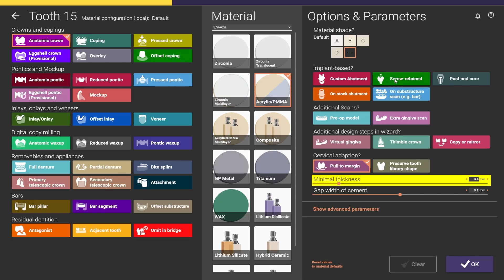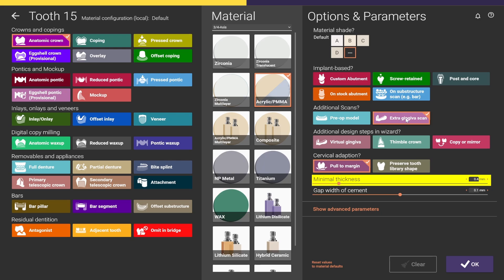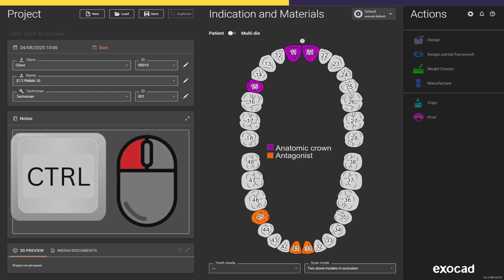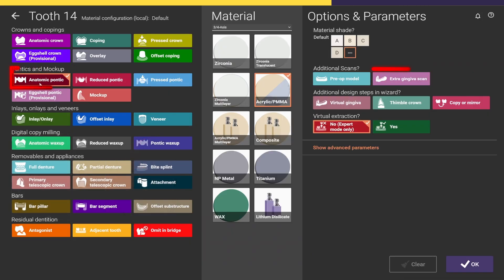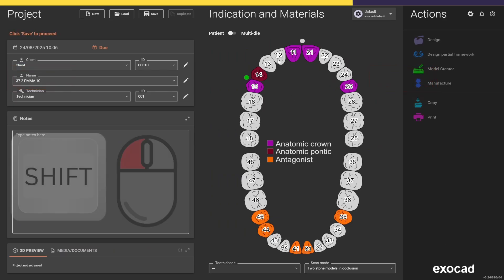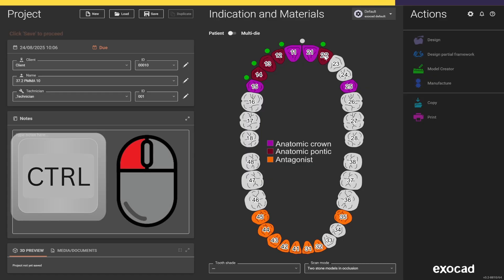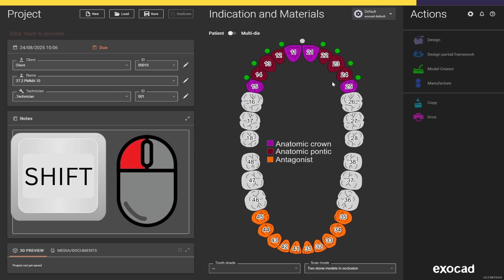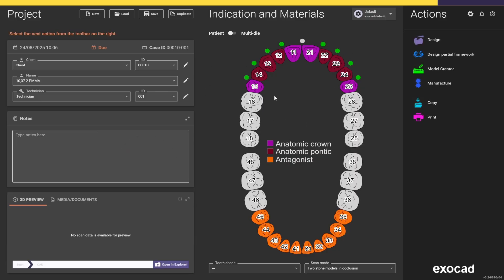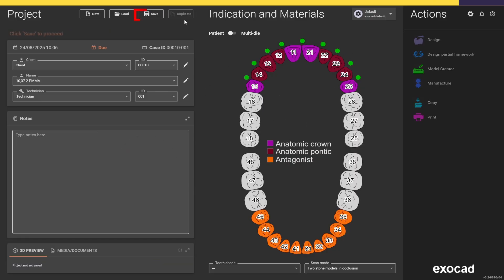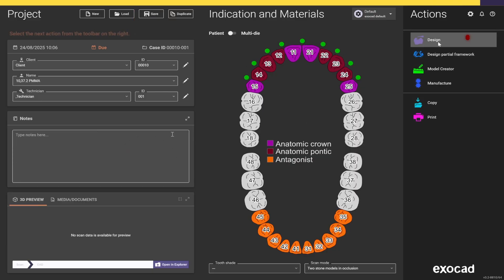This is going to be a cement retained bridge, so I don't need to select anything here — it's just as if it was a normal bridge on a prep. So I need an extra gingiva scan, then I select OK. I select the retainers pressing Ctrl-Left-Click, and now I select the Pontics pressing Shift-Left-Click to select the other teeth. After everything is selected, I save the project and we select Design.